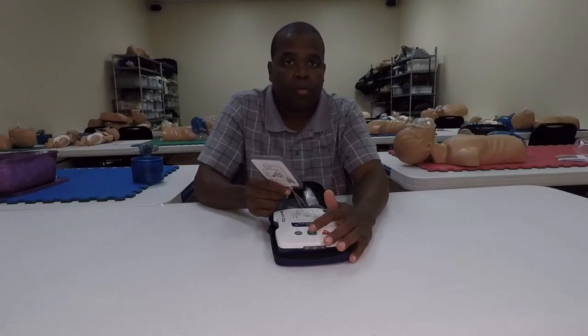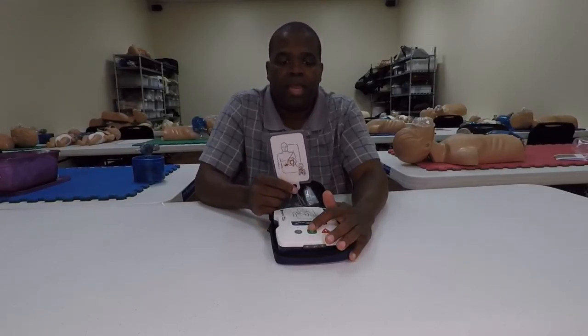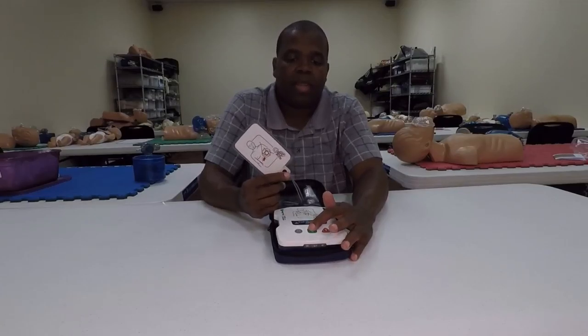It's ideal for use on a Prestan mannequin and also on any other hard mannequins you utilize. Some of the softer mannequins — such as your CPR Prompt mannequins or Sandy Man — if they're not as rigid, you may run into a little bit of difficulty.